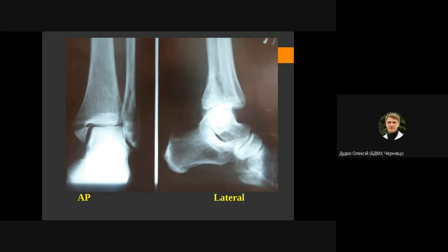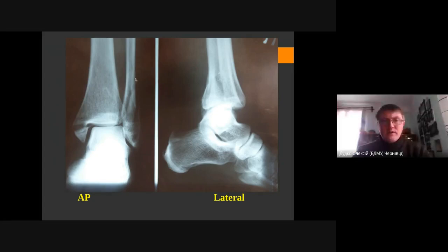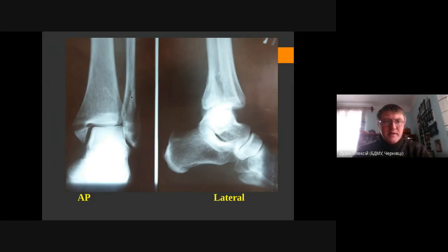So we have a fracture of the medial malleolus with displacement. Now let's go along the fibula — as we see, there's a contour of the fibula and there are some fracture lines here, which indicates a fracture with some displacement.